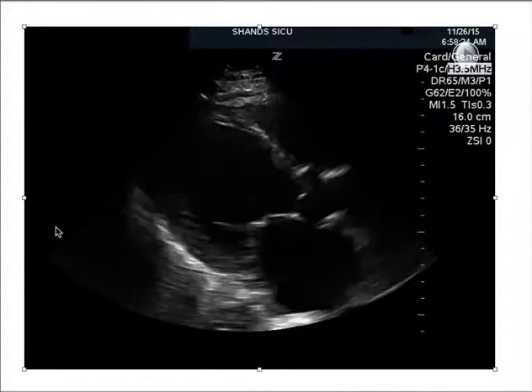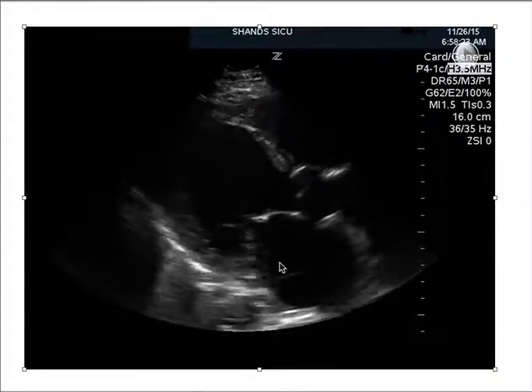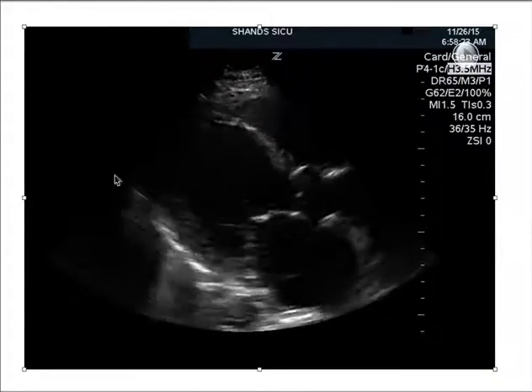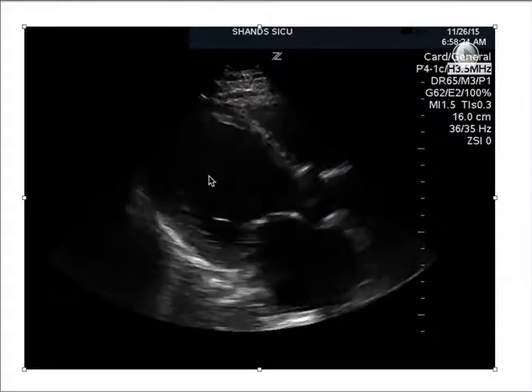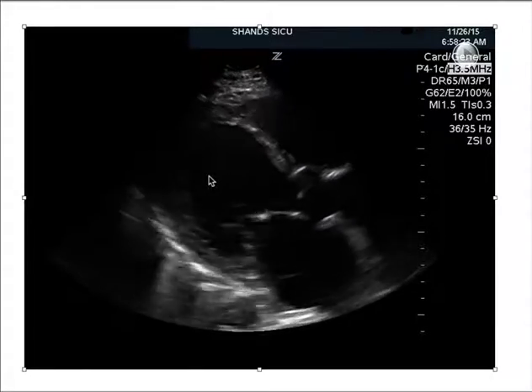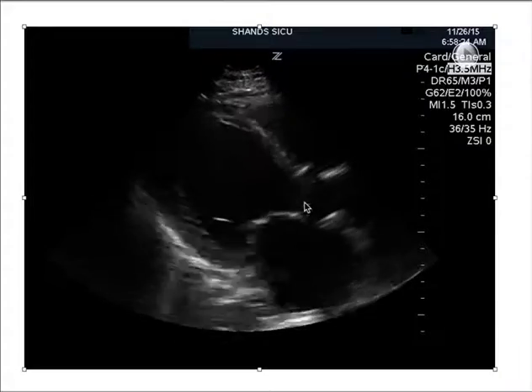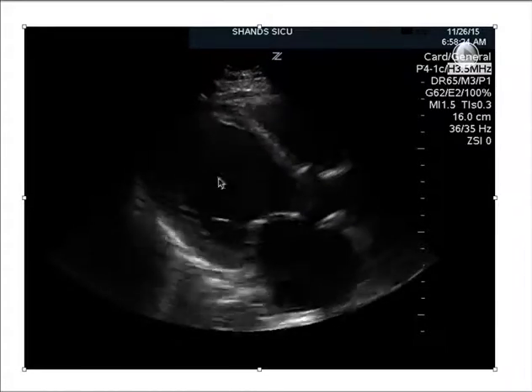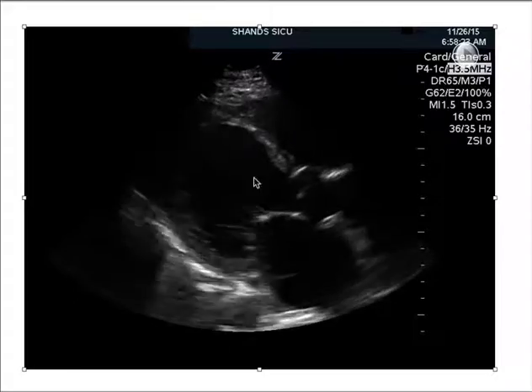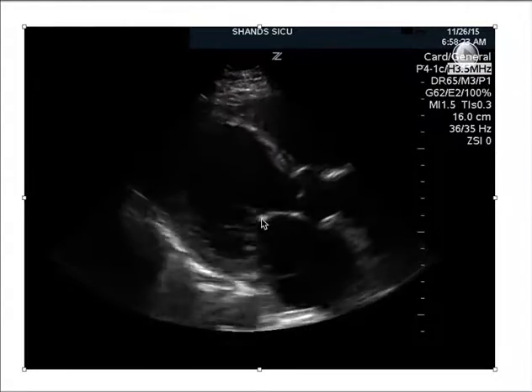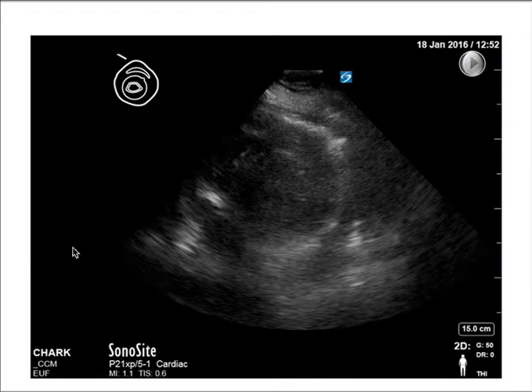Here's another image of poor heart function in the parasternal long view. You see the left atrium, left ventricle, right ventricle, mitral valve, and aortic valve. There's a large dilated left ventricle, and the mitral valve is not touching the LV wall — indicating poor function.